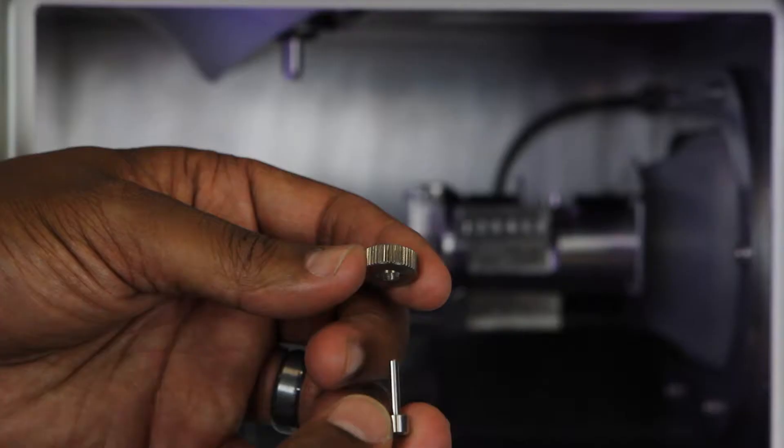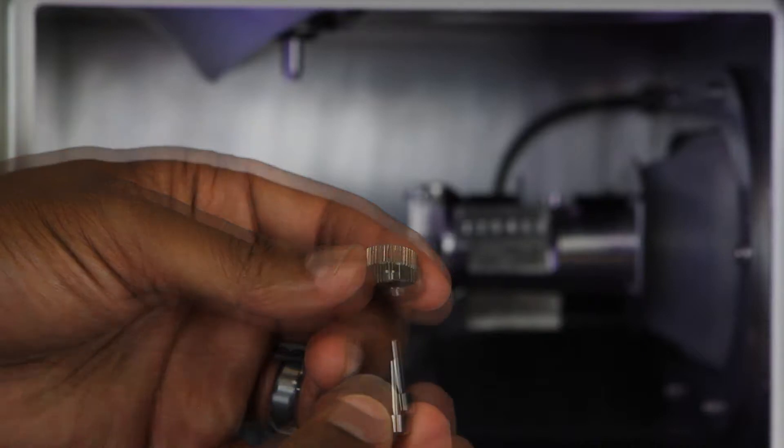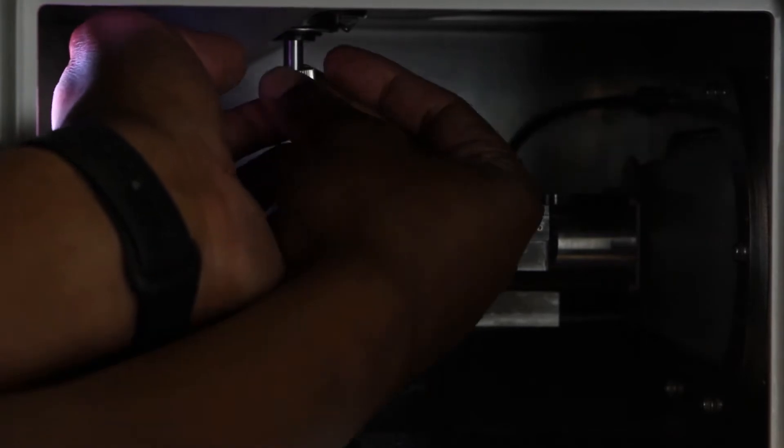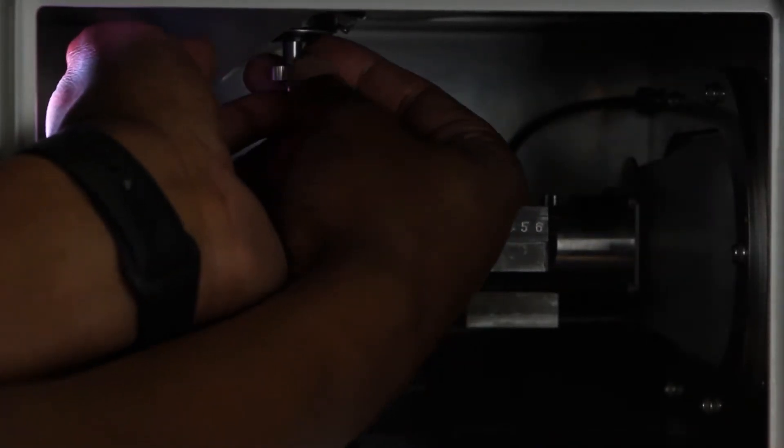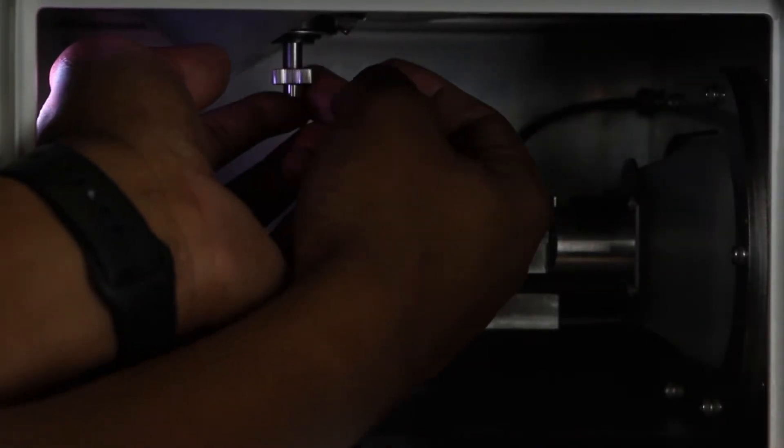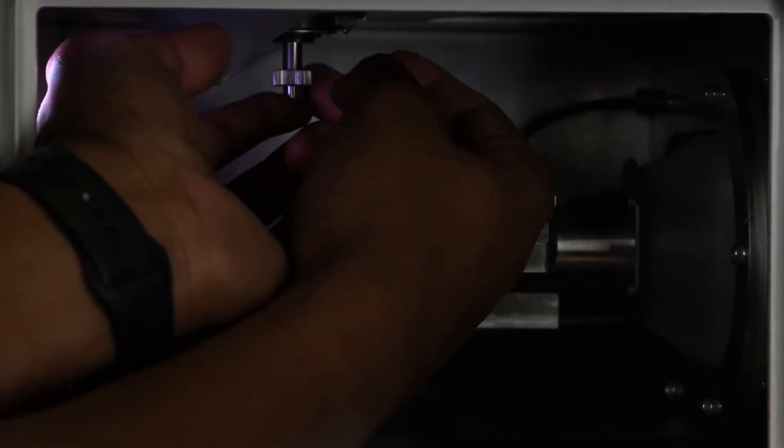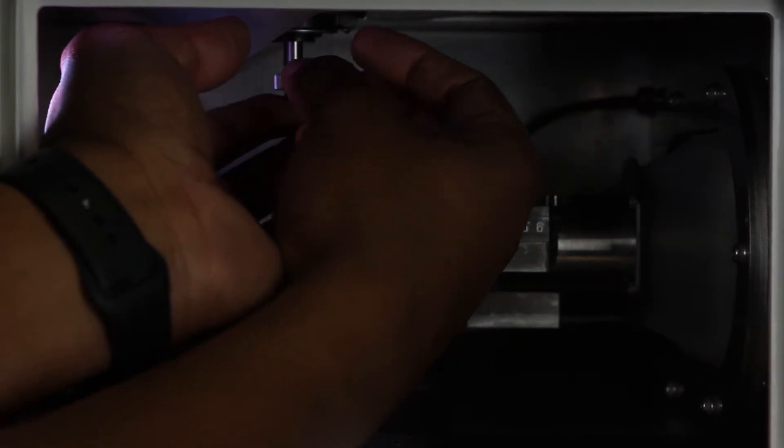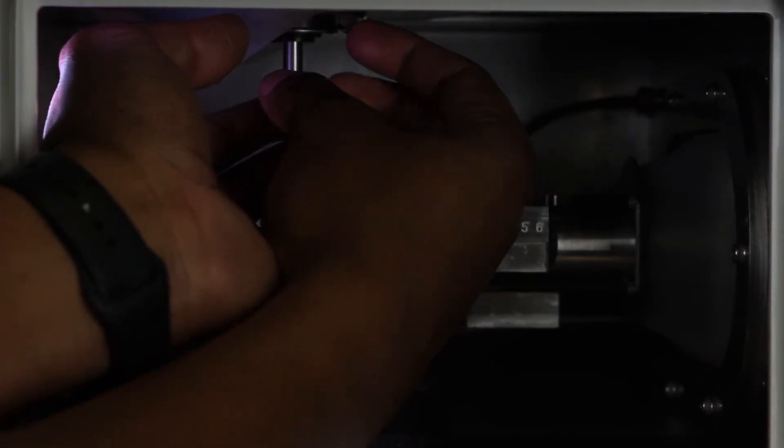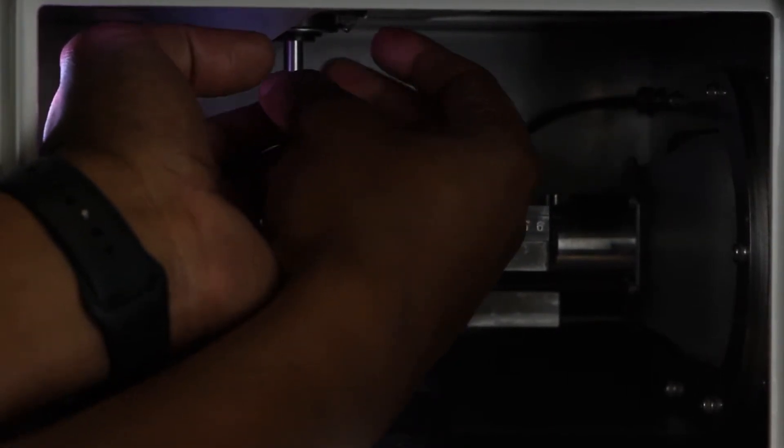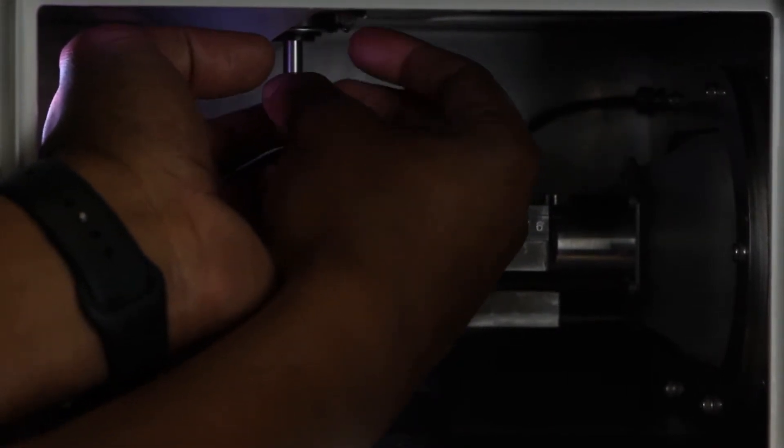You will need the collet tap and collet replacement jig to remove the collet from the spindle head. Insert the collet tap and replacement jig onto the collet. Next, hold the collet tap in position by placing a finger firmly against the bottom of the collet tap, pressing upwards. Using the other hand, turn the collet replacement jig clockwise or to the right to remove the collet from the spindle.